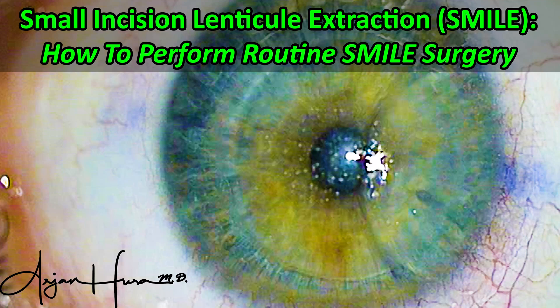SMILE — small incision lenticule extraction. In this video, we cover the basics on how to perform a routine SMILE surgery case.